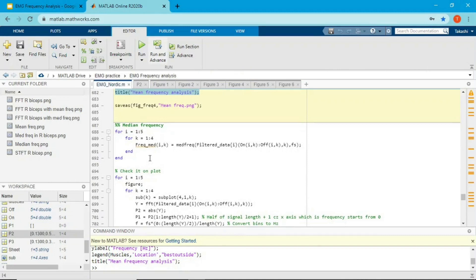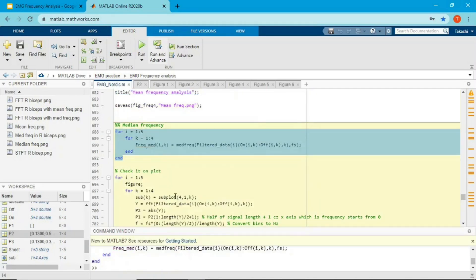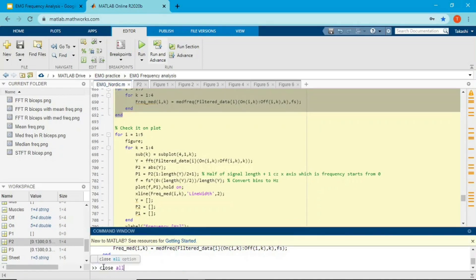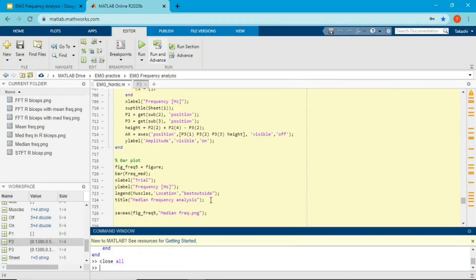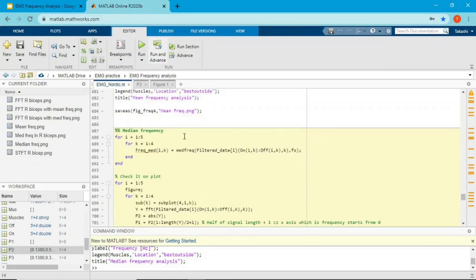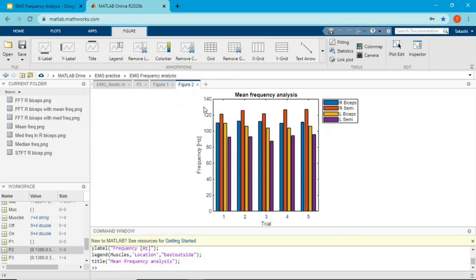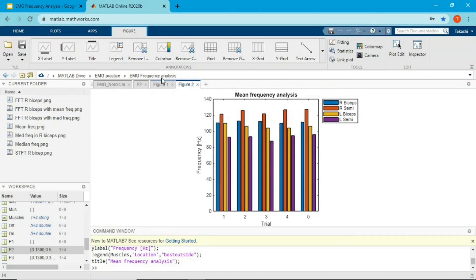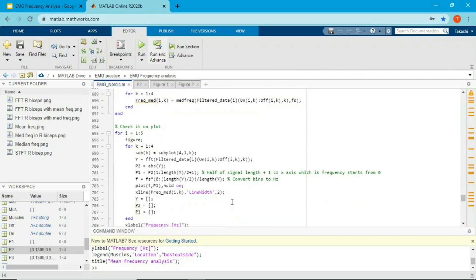Median frequency analysis is very similar, but using median instead of mean — the function is called medfreq, not meanfreq, and the input arguments are the same. The bar plot looks similar, but the frequency values differ slightly — for example, around 120 Hz with mean versus around 100 Hz with median. Mean frequency tends to overestimate compared to median frequency. You can use either, but stick to one analysis method.